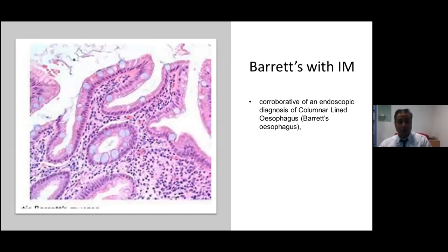Another scenario is where you don't see the esophageal squamous mucosa, but under the microscope you see glandular mucosa with very pronounced intestinal metaplasia or goblet cells and mild scattered inflammation in the background. Again, we say the appearances are corroborative of an endoscopic diagnosis of columnar-lined esophagus or Barrett's esophagus, provided the biopsy is from the native esophagus.